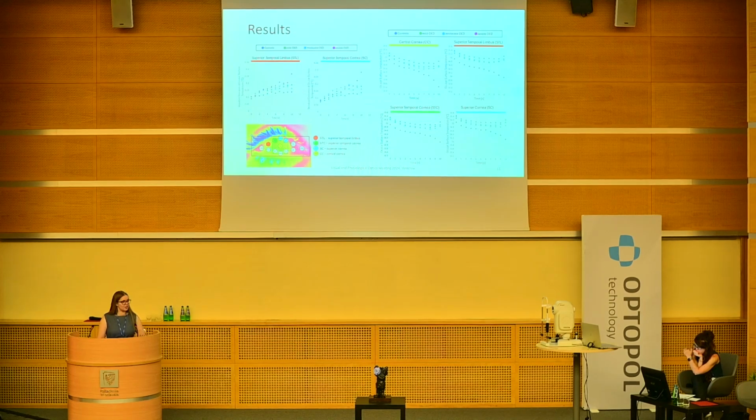The results, these are just examples of how it looked. So the temperature changed through time, and the minimum and maximum temperatures in those particular areas weren't that much of an interest. I mean, we could assess based on them what's the minimum and maximum temperature on the human eye, but the averages and standard deviations of these were following the time.